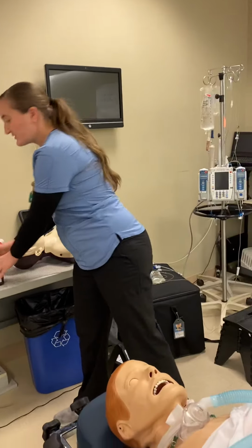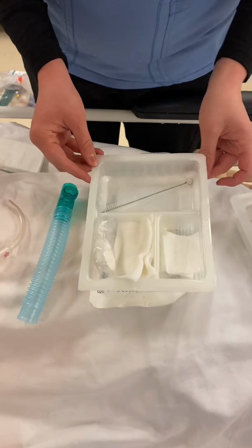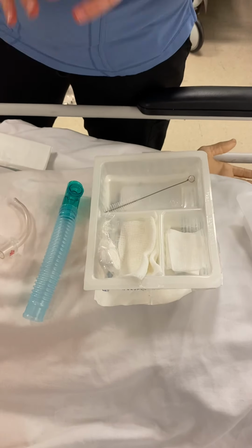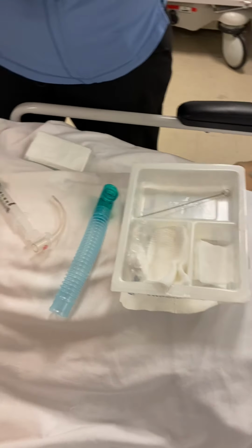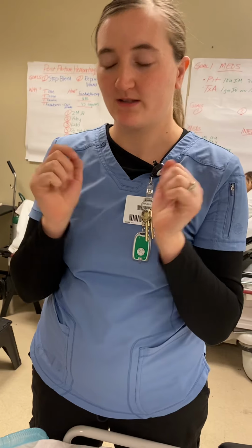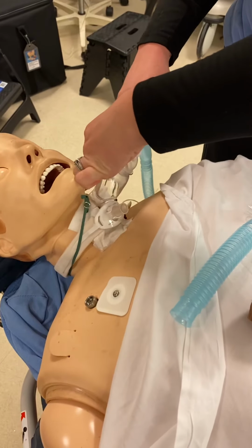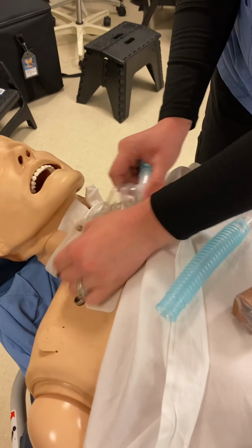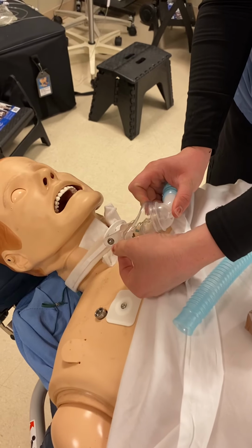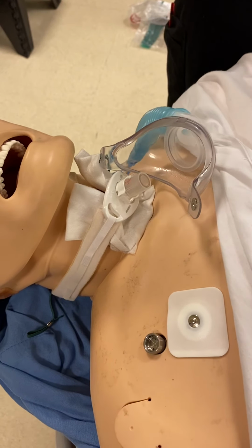Once you've got your solution set up, I like to clean the outside first. I like to clean from the cleanest to the dirtiest, and I'll show you what I mean. So you're just going to unsnap your trach mask, and you can let oxygen blow by, so it doesn't have to be all the way off.